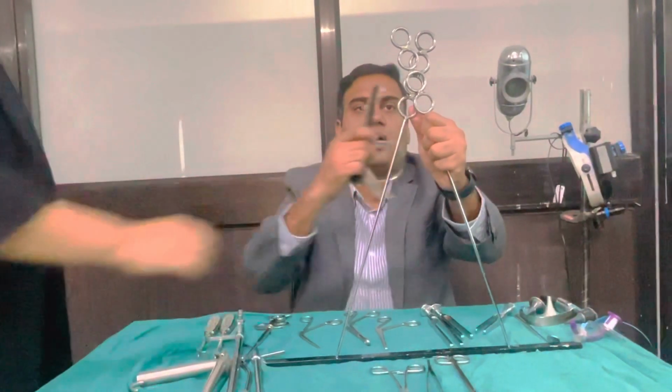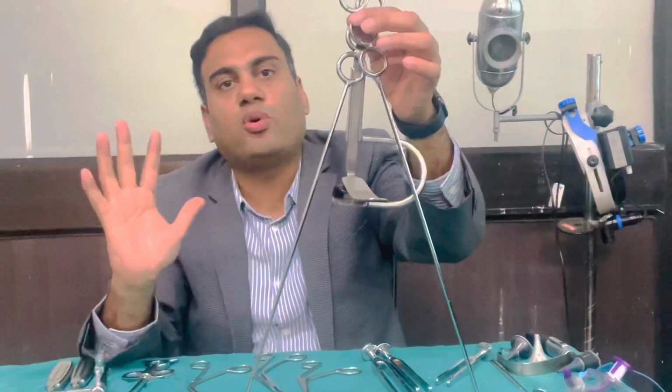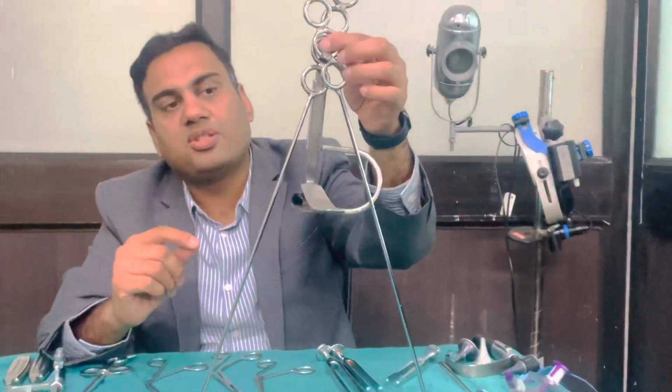And this is exactly how this will get suspended. So once this is done, both your hands are free to perform the surgery.